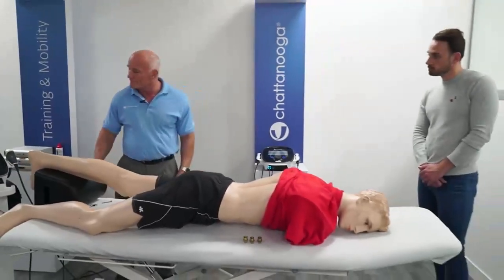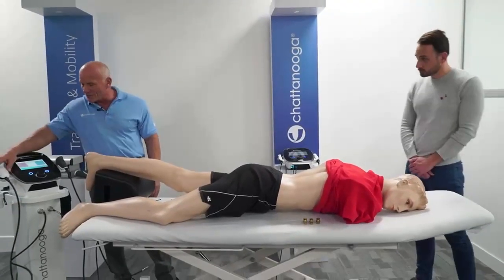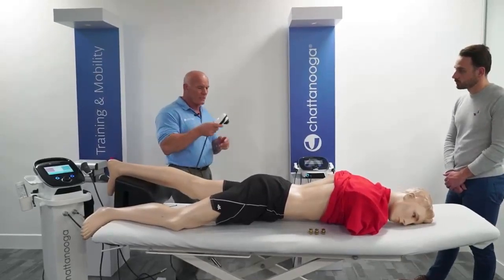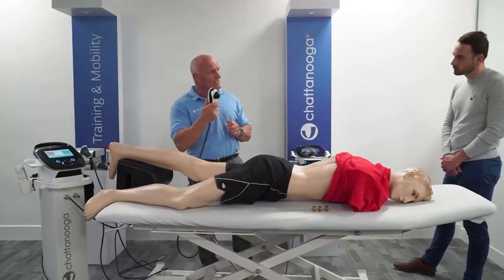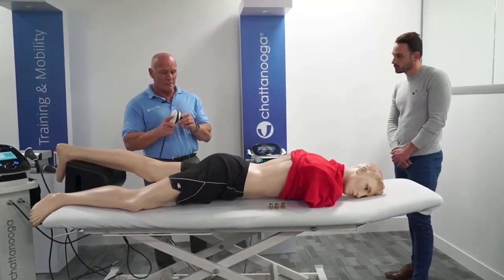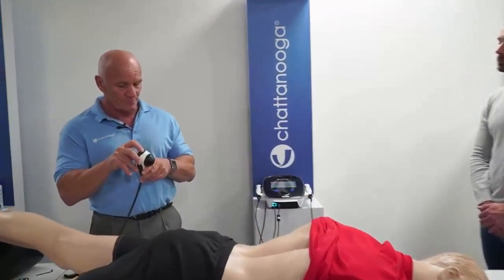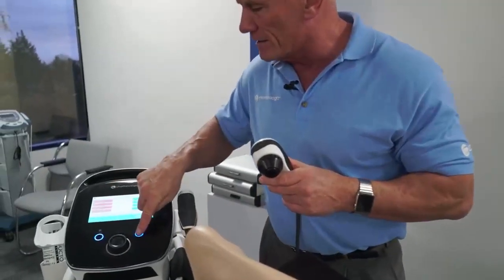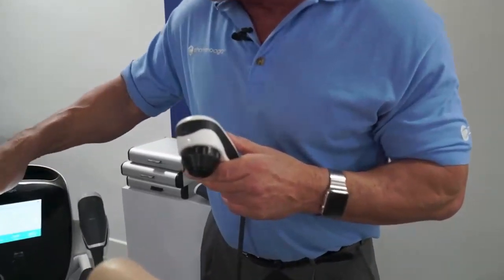I think you mentioned this. I know it looks a strange contraption. This is actually an optional extra. It's called the V actor, HF for high frequency, because we can go from frequencies of 1 hertz to 50 hertz. I'll just stop this treatment and exit, and I'm going to go to the V actor now.